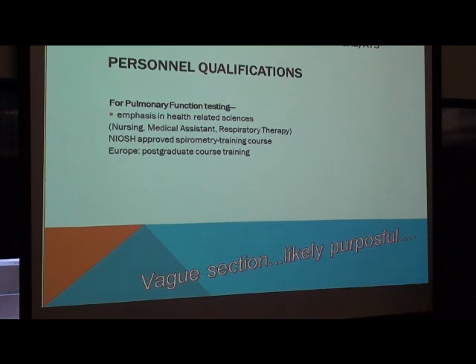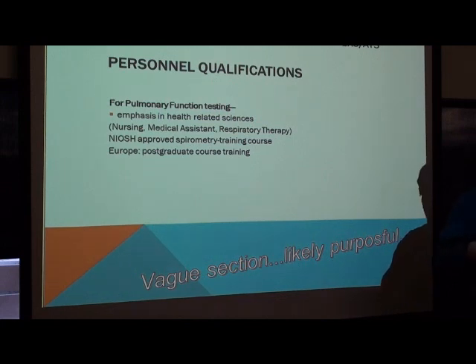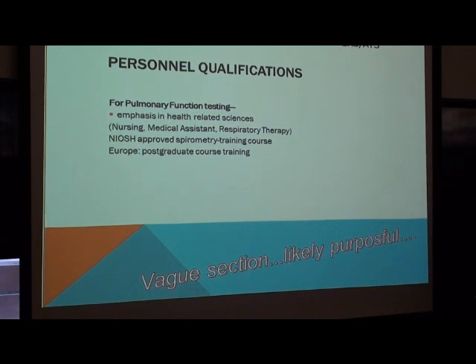They were developed at a time when volume displacement spirometers were the norm, prior to computerization of those systems. So a good part of that 2.5 days is spent learning how to hand measure and convert distances on a piece of paper to an FEV1 and an FVC, and manually convert that from ATPS to BTPS. In short, a lot of time is spent doing stuff that you'll never do again. The computer does it for you. So I wish there was a better course. I don't feel strongly that people that work in this laboratory would benefit from attending. It wouldn't hurt you, but you won't benefit that much from it.